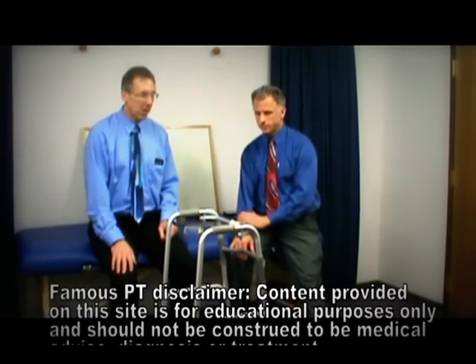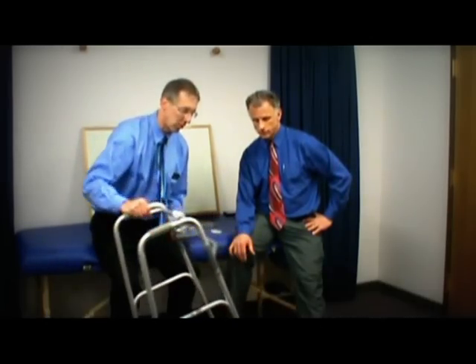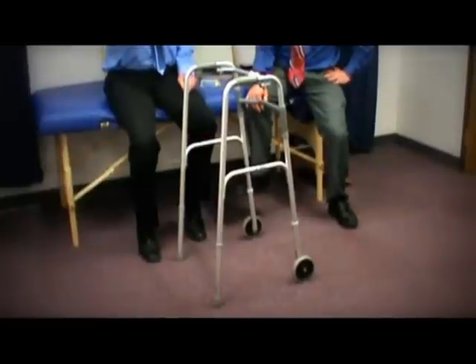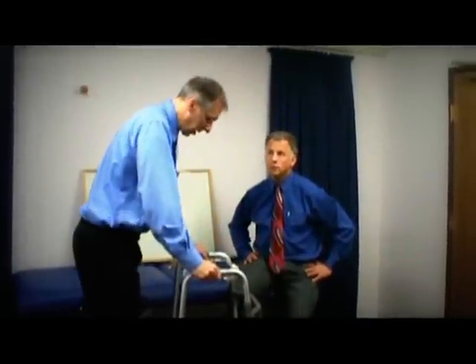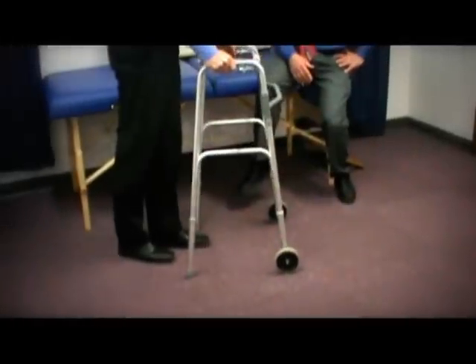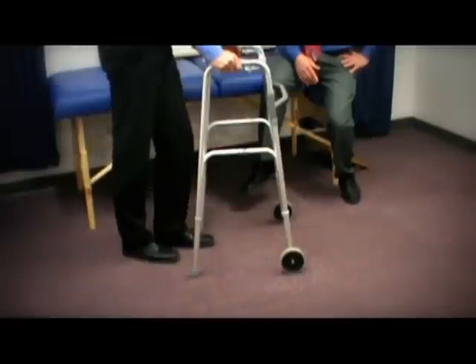Today, Brad, we're going to talk about just the wheeled walker. This is what we call a front wheeled walker. It only has wheels on the front. Now, one of the concerns people have brought up over the years is that they're afraid the walker is going to get away from them. But when you have the two back legs without wheels, this is a pretty stable walker. Yes, it is. This is probably the walker of choice that we use with most of our patients.